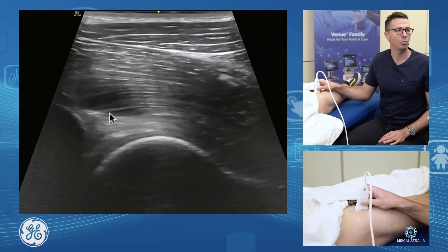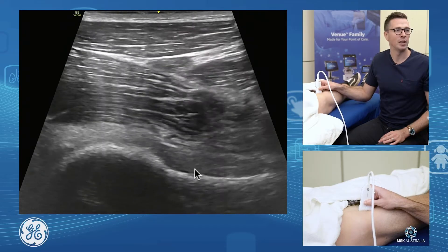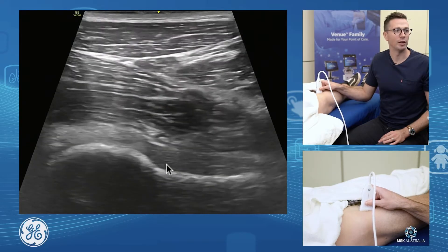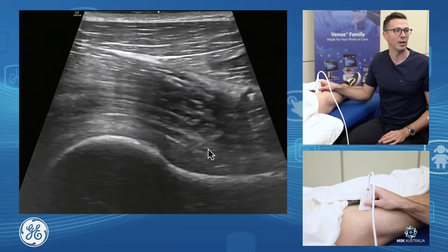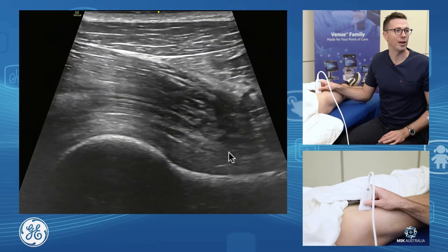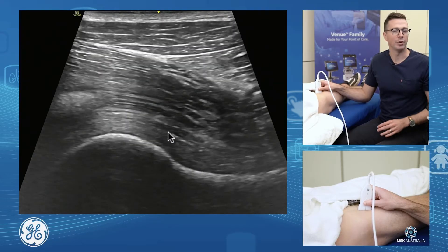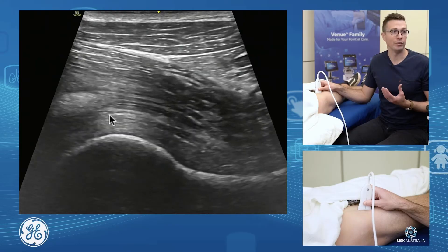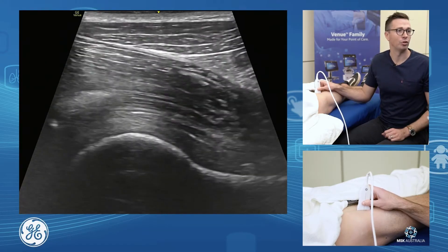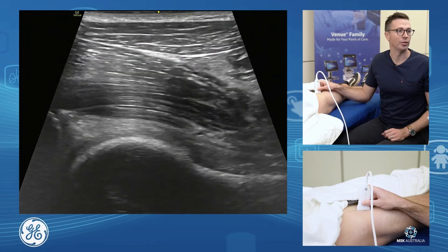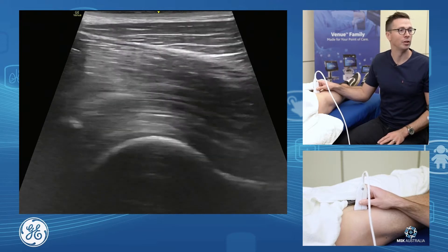We'll scan down and assess the femoral head-neck junction, and we'll have a look at our hip joint capsule itself. The capsule anteriorly is the anterior iliofemoral ligament. So if you were to have a joint effusion, this is where it would be. If you were to have joint synovitis, this is where it would be, within the joint capsule itself.